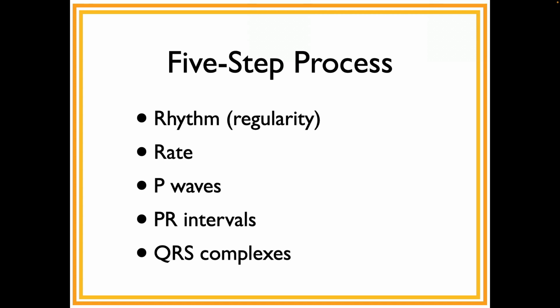What happens when you're learning ECG identification, learning ECG analysis, pretty quick you're going to start recognizing some things, and you're going to skip over the process and look and say, oh, that's a sinus bradycardia, okay? And you'll be able to do that without going through these 5 steps, okay? And it's very tempting to think, oh, I'm going to be able to look at everything and identify everything. And the more you do it, the more you will be able to do this, is not have to go through a tedious 5-step process. You'll kind of look at it, make a few measurements, and know what it is.